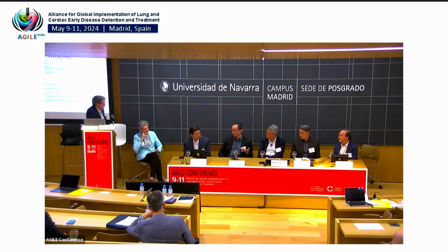There are more software packages now that will measure them from full field of view CT scans. Whether or not they will succeed with low dose environments like 0.7 millisieverts remains a question. I think many of them will succeed at the 1.5 millisievert cutoff, but if you drop below 1 millisievert, they probably will fail, many of them.